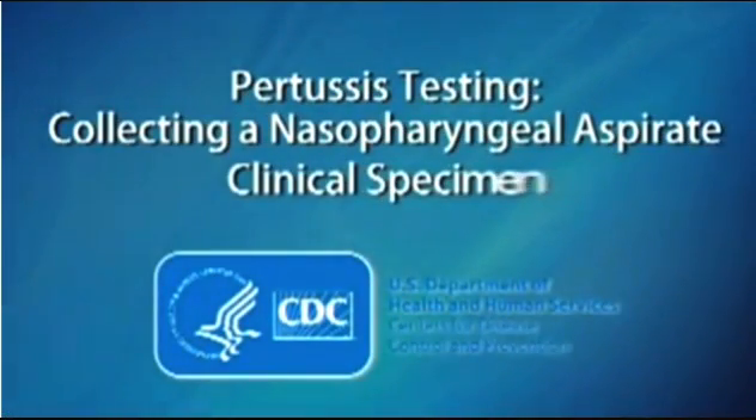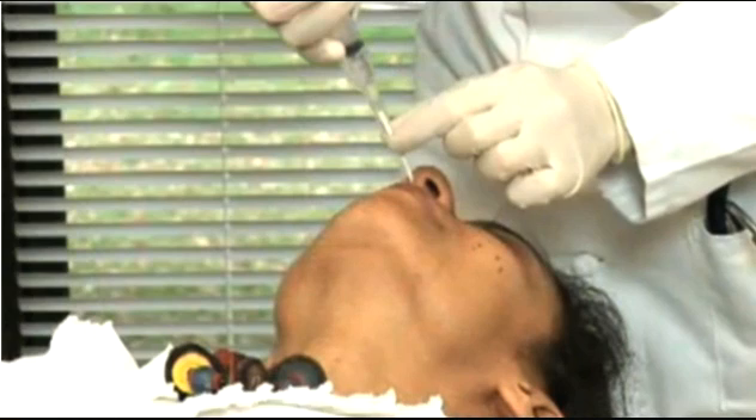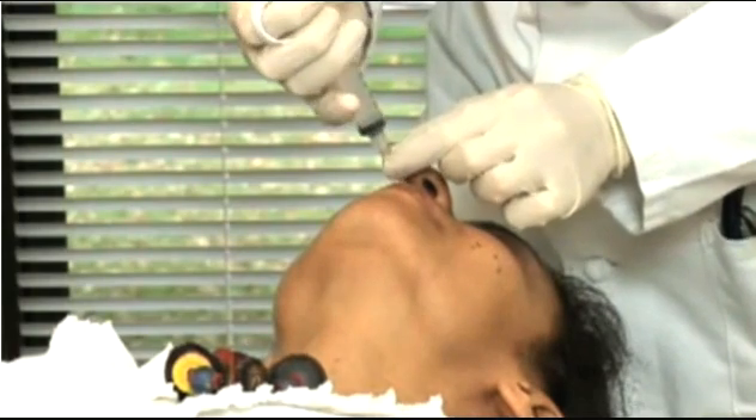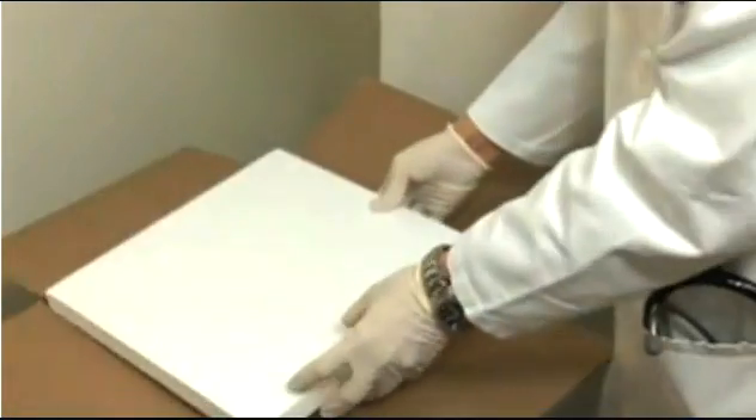Pertussis Testing: Collecting a Nasopharyngeal Aspirate Clinical Specimen. It is essential to use correct technique when collecting and transporting specimens for laboratory testing. This video will demonstrate how to correctly collect and transport a nasopharyngeal aspirate.